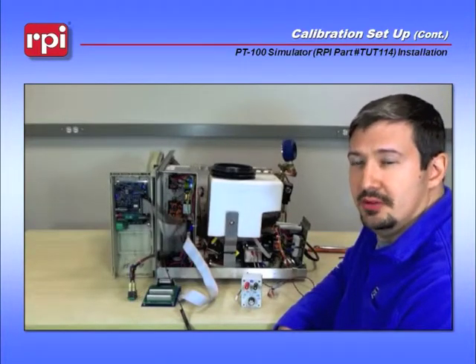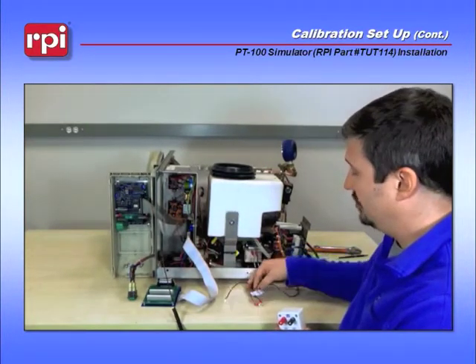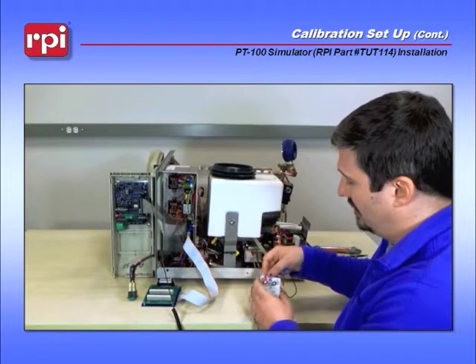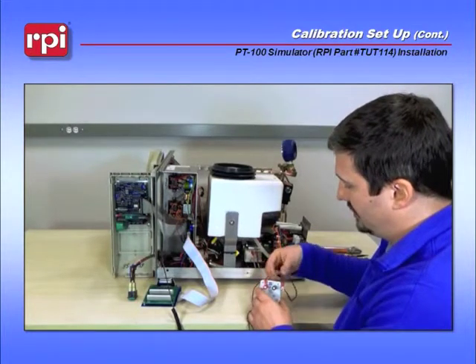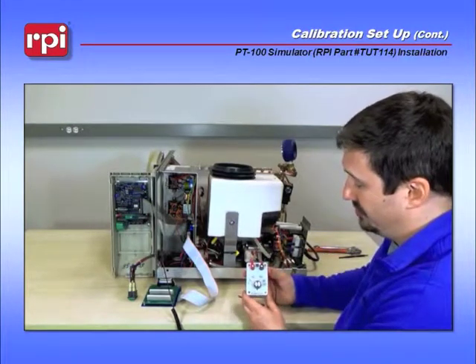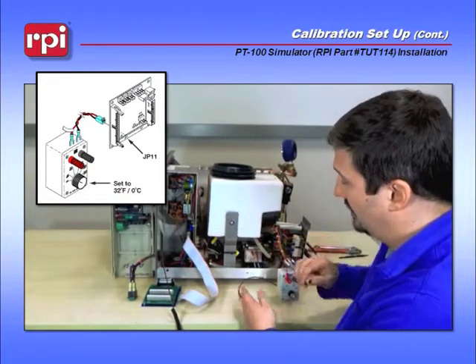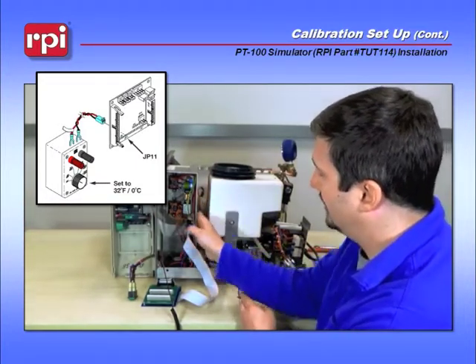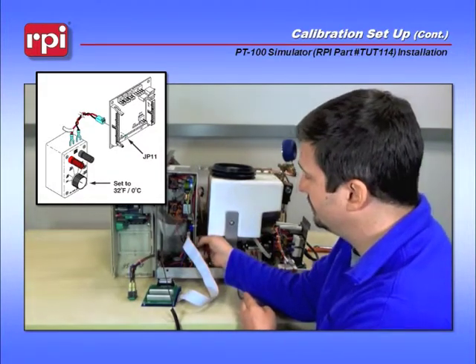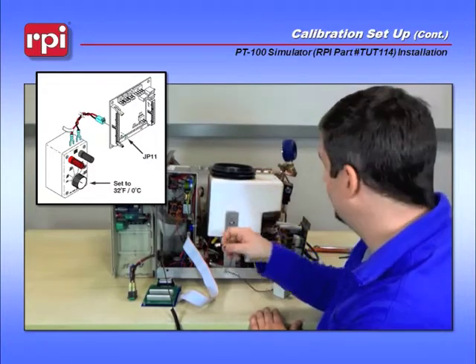The next part of the calibration setup is to take the TUT-114, which is your PT-100 simulator, and connect it to the wire harness TU-111. Connect red to red and black to black. Tighten down the fittings until they're snug. Make sure that your TUT-114 is placed at the zero degree mark. Next, reach in behind where your adjunct board is to a small two-pin connector at JP-11 — this is your temperature sensor — disconnect it, and place in the same spot the TU-111 harness.